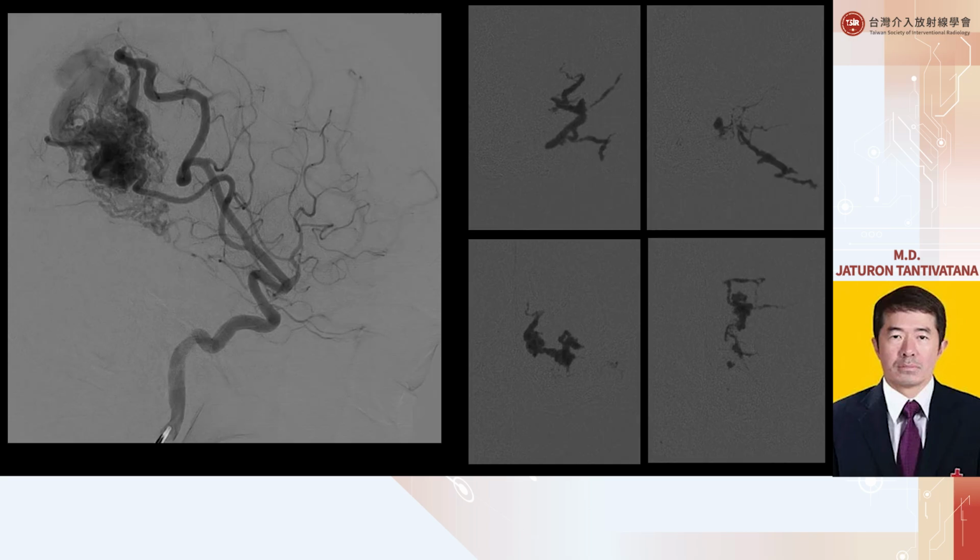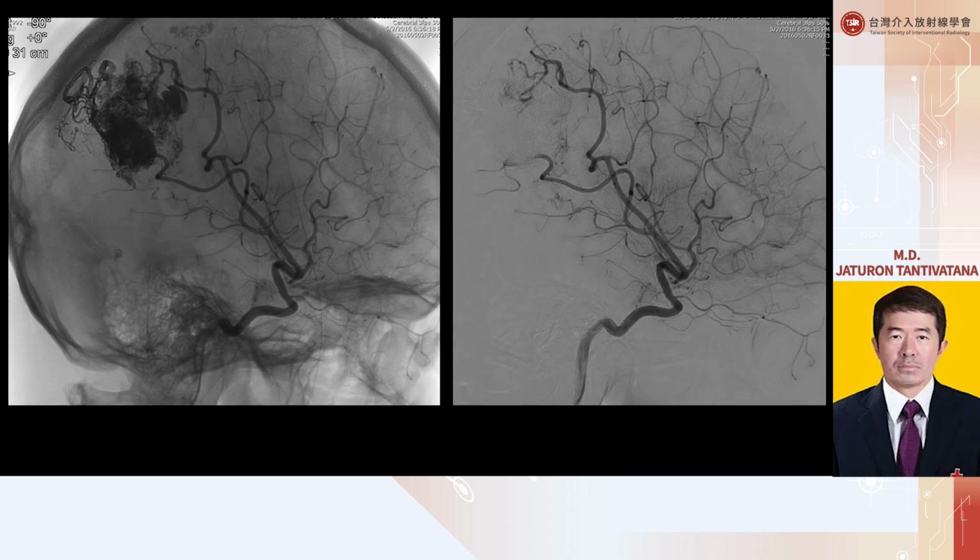This is another brain AVM using the same technique, push and plug and then pause again. In this way, you can get to the different compartments which have different resistance and eventually get the whole nidus. Like this one, this is the example of the whole nidus.